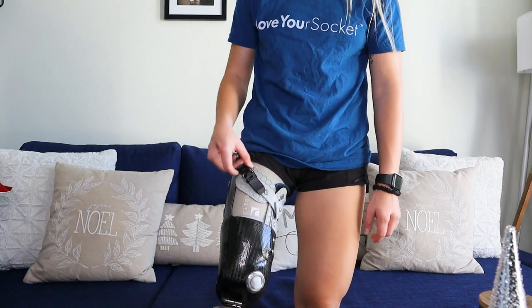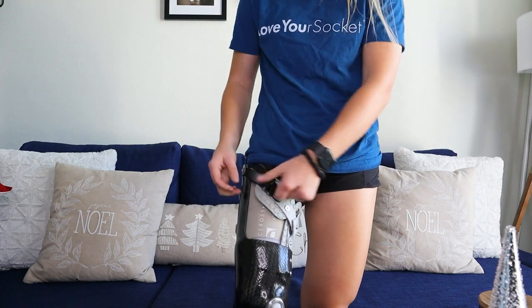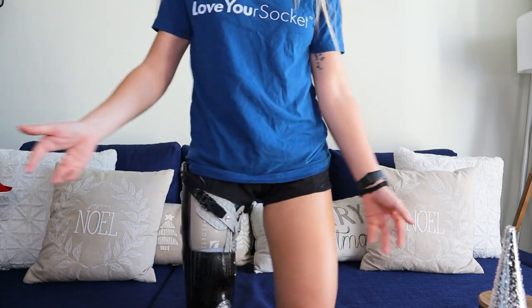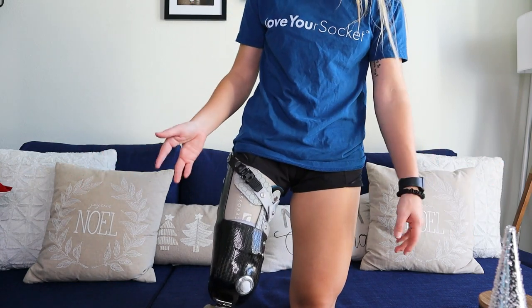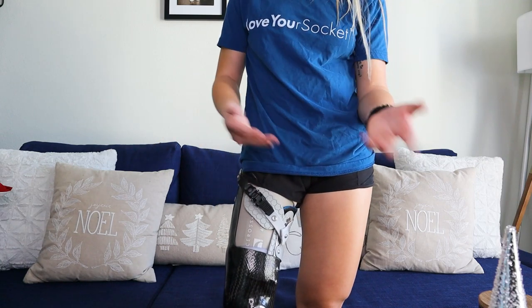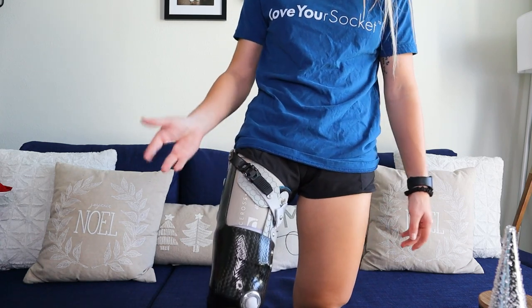It has this ratchet strap that loosens or tightens it. On mornings when my stump is a little more swollen, I'll wear it kind of loose and it's still good — I can still wear it no problem. As the day goes on, I can just tighten it as needed. And it's that easy. That's literally it. Goodbye socks. All I have to do is this little ratchet thing.